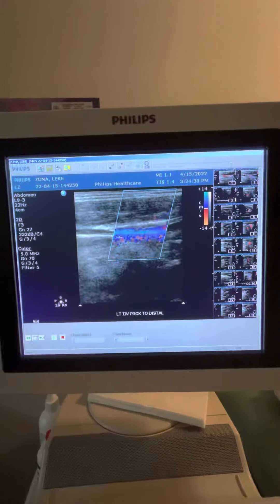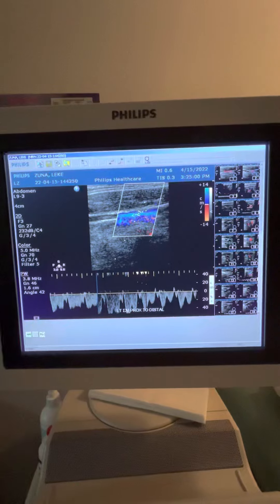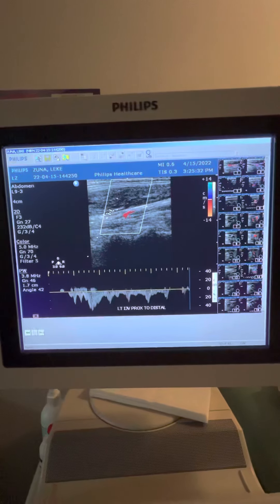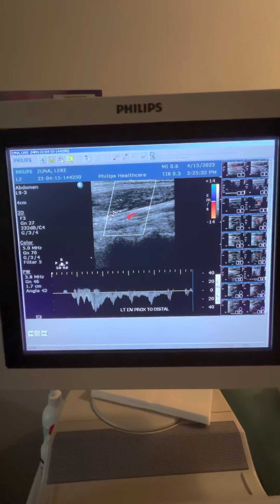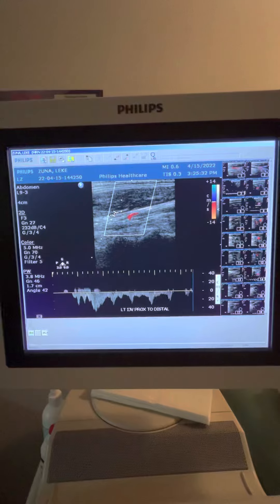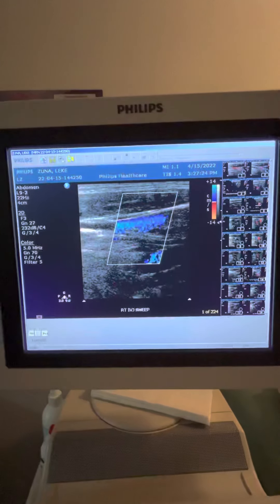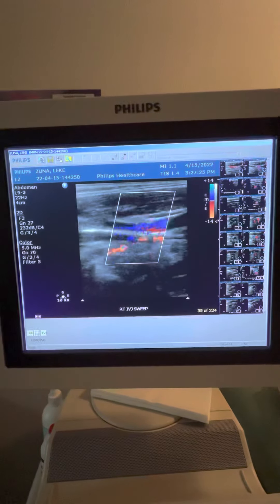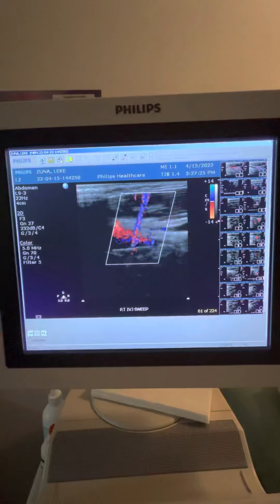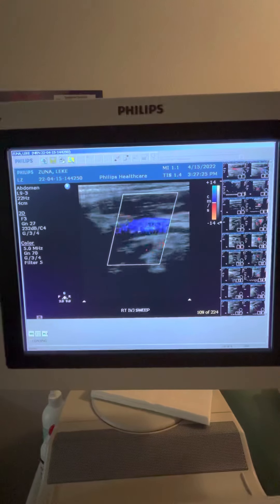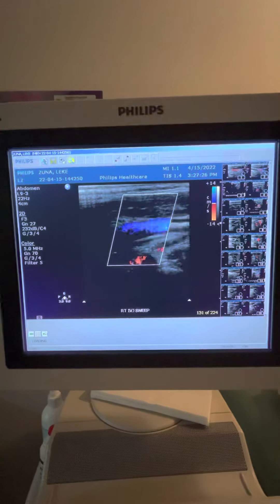Doppler flow, left internal jugular vein. Proximal to mid. Mid to distal sample Doppler. Doppler vertebral vein, one more sweep, past the carotid bulb.